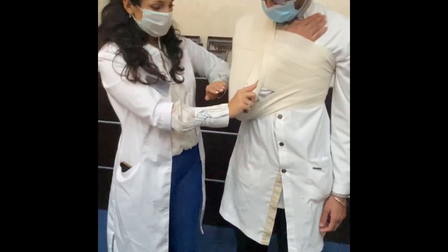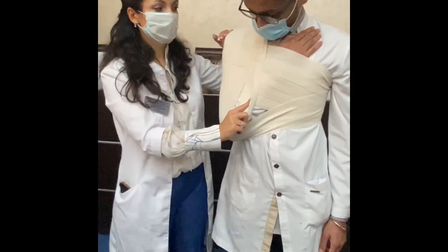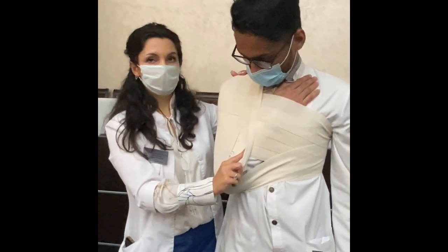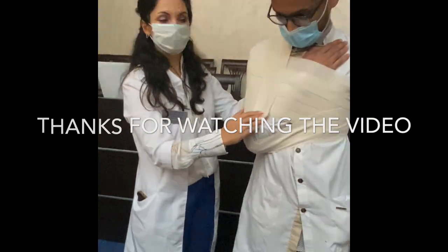Everything should be covered, and the direction goes from down to up, and here from the joint to the neck. This is immobilization — you can see the patient can't move.